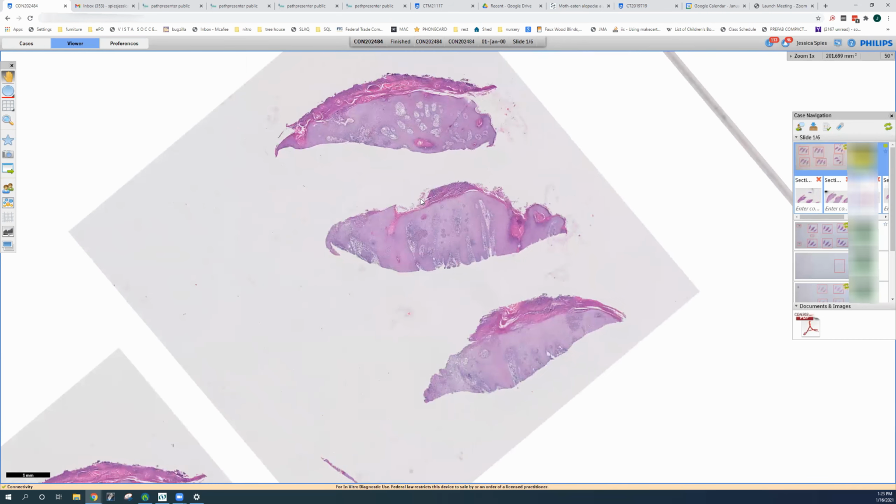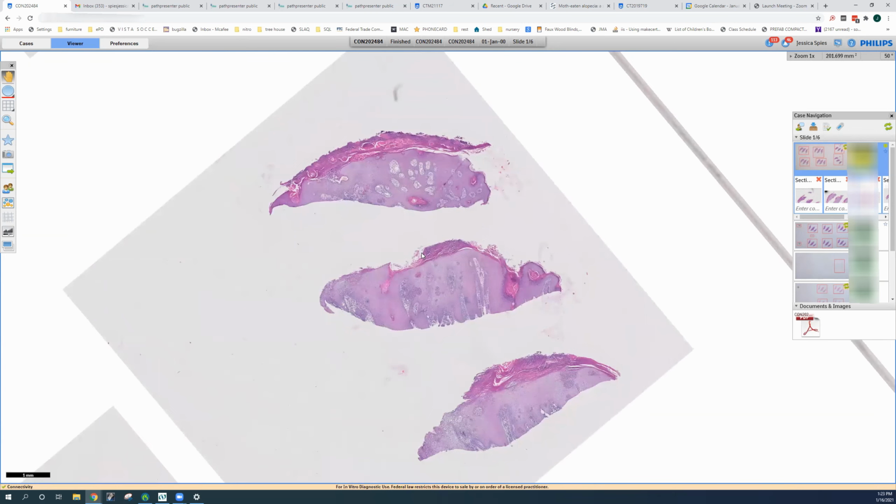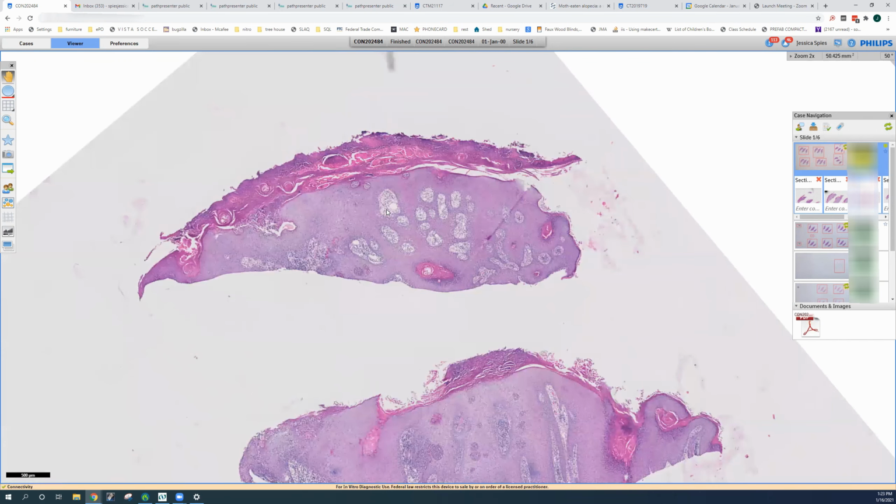Okay, and this was a 63-year-old male with an erythematous ulcerated plaque in the perianal region. The clinical differential was to rule out squamous cell carcinoma or condyloma. And this is another lesion of secondary syphilis that we don't see very often. And this is condyloma lata.